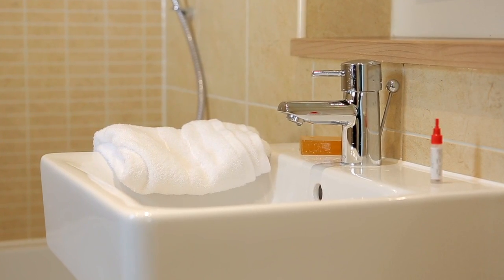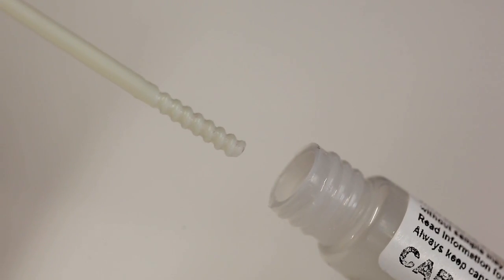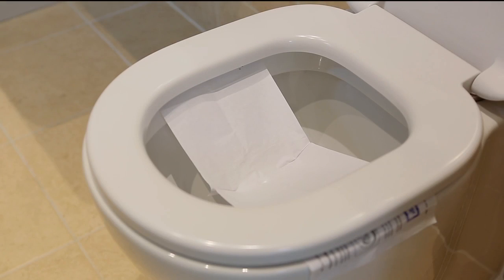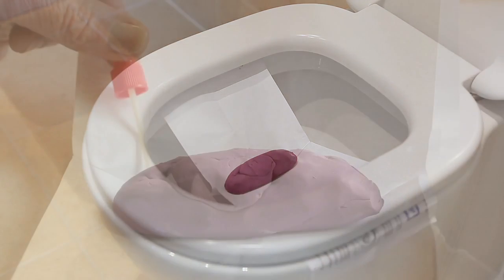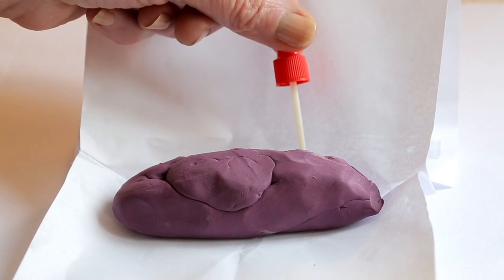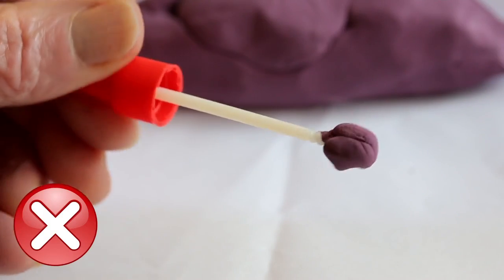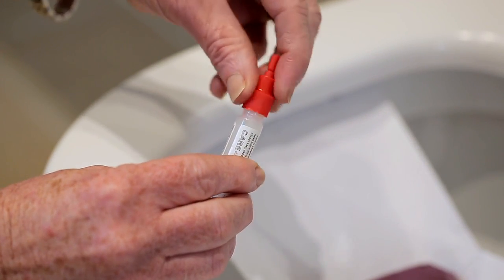After your bowel movement reach for the tube, unscrew the lid and you will find a stick attached. Continue to hold the lid and you will see that the base of the stick is slightly ridged. This is what the sample will cling to. Holding the lid of the tube, gently push the stick into your stool in five different places and then remove it, making sure there's not too much attached. Carefully put it back into the sample tube and screw the lid on tightly.